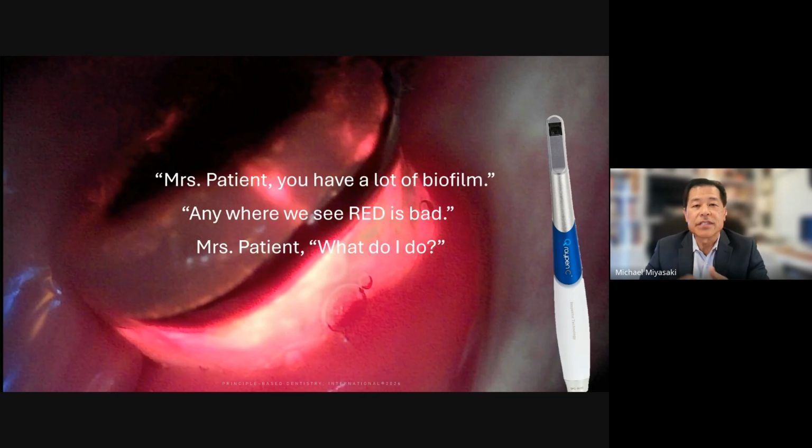It's a whole different scenario, right? Before, they were completely in the dark. We didn't show them any images. We just told them what was going on. And then the next level up is we show them an image of what's going on with the intraoral camera. But they don't see anything, right?